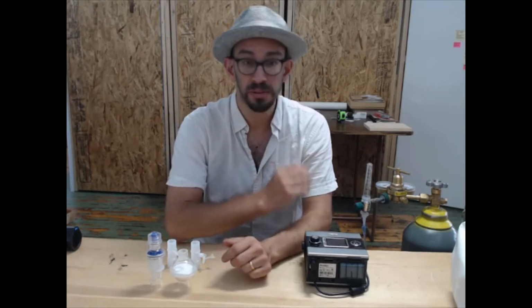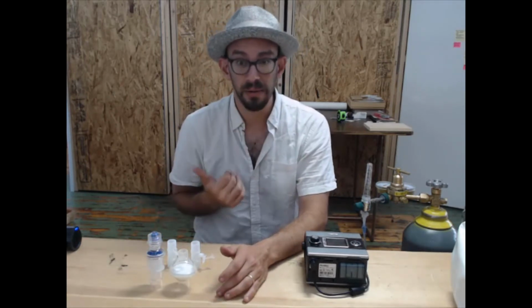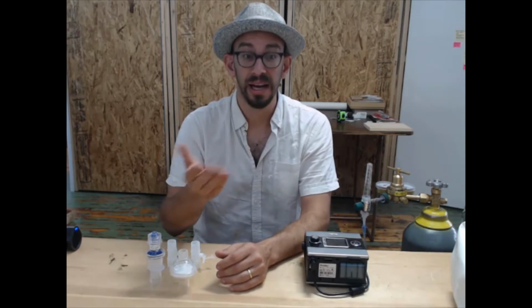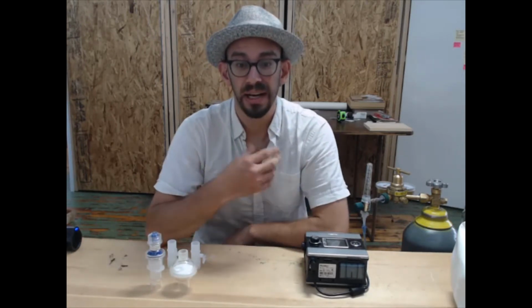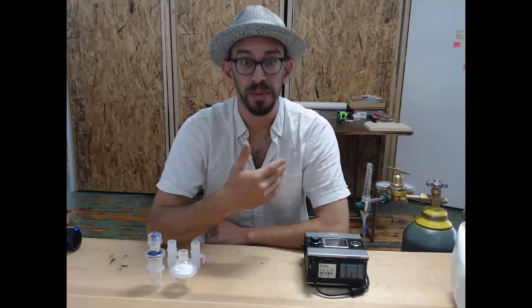The only treatment this provides is oxygen and positive airway pressure. And so it's not providing bi-level airway pressure. It can't increase a patient's tidal volume. And if your patient is at that state, you should be looking at other treatments like intubation and mechanical ventilation.